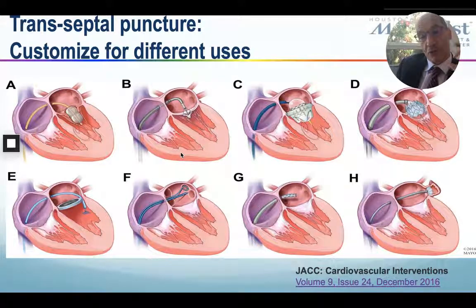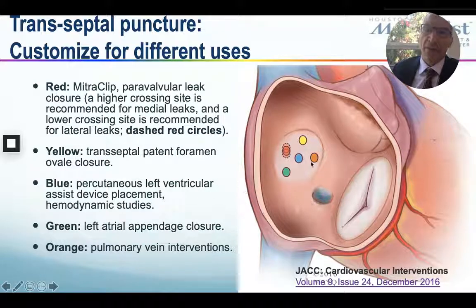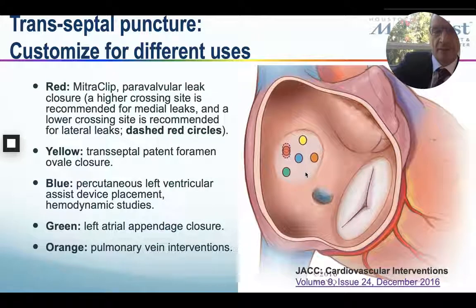And for appendage closure, we are taught when we start these procedures that you need to have a posterior and inferior puncture. That was deeply ingrained in most of the reps and technicians that support these procedures. But I would make a case that sure, it is important to do an inferior puncture, but I'm not so sure it is so important to do it posterior. You need to do it at an angle where you have a straight line from the septum to the appendage. And that's typically in this cartoon shown here where the recommended puncture site for the appendage closure is. I would argue that anywhere low, particularly I prefer to do it a little bit more anterior, is good as long as you stay in the fossa ovalis.